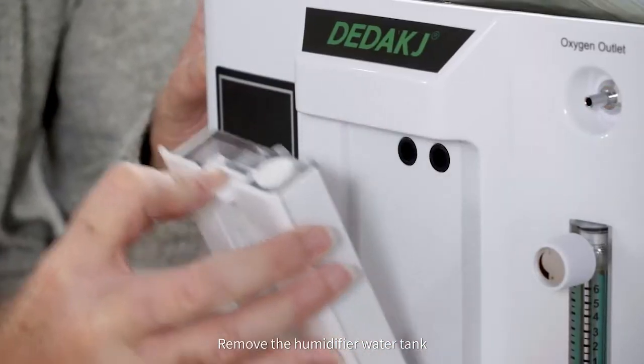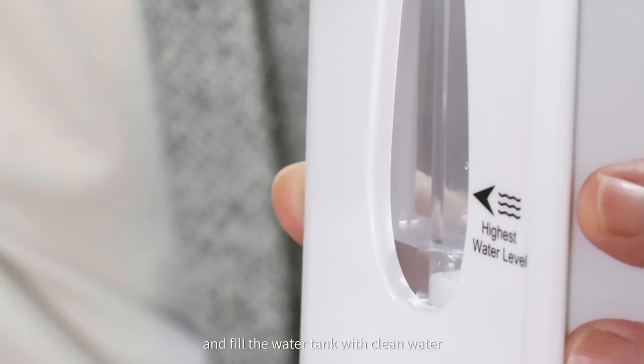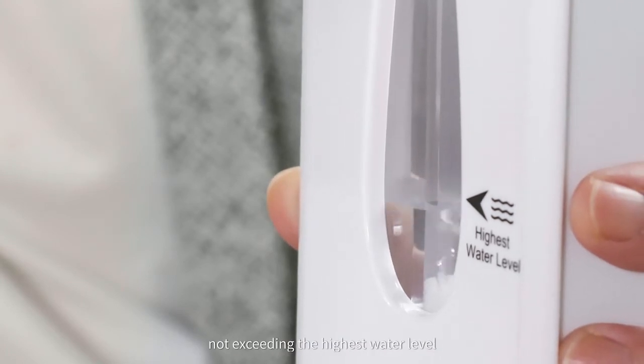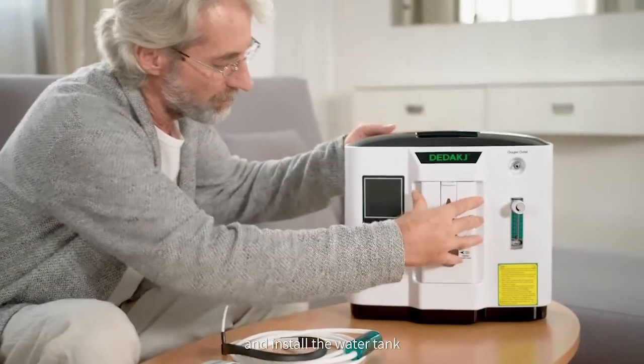Remove the humidifier water tank, open the rubber stopper, and fill the water tank with clean water, not exceeding the highest water level. Plug the rubber stopper and install the water tank.